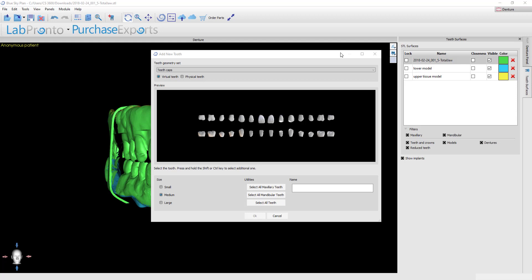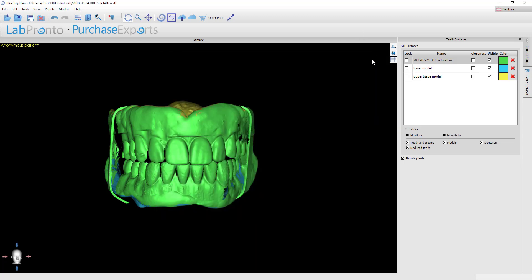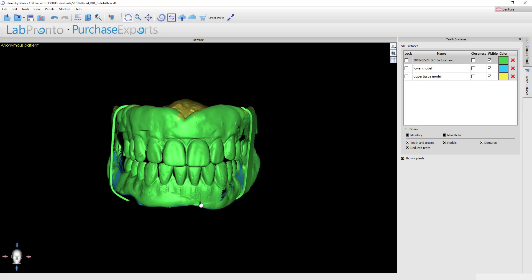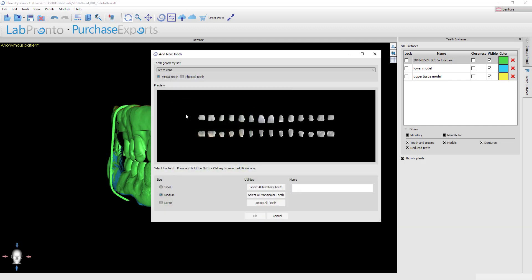Once you click the button to continue on to the denture planning, this will be the first screen that comes up. I should mention also that if for whatever reason you cancel out of the wizard and you're stuck right here, simply come up here to the plus sign with the tooth beside it and hit that and you'll be right back to the same screen.